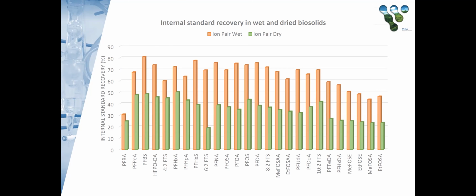When you dry a sample, you'd expect all the analytes in the aqueous phase to dry onto the solid phase and should be still extracted. Some of the shorter chains can be harder to recover, and there are some PFAS that are a little bit more volatile. But to have this across the board suggests that maybe there was a reduction in efficiency of getting it from the solid surfaces, including the container wall.